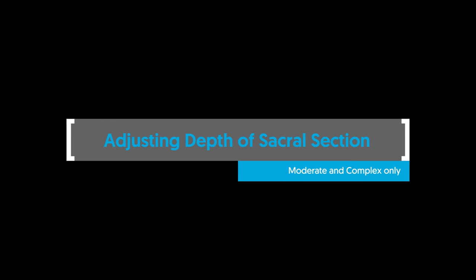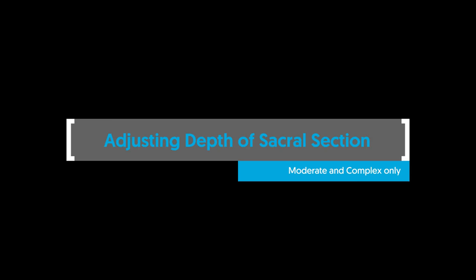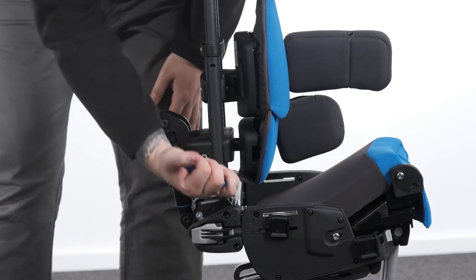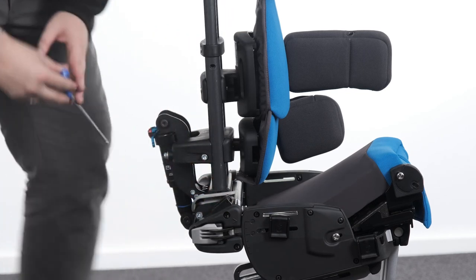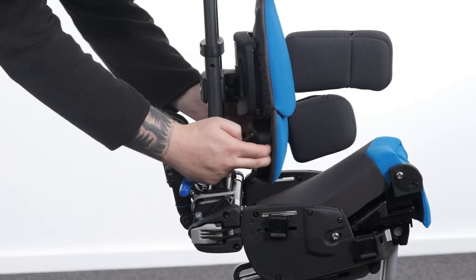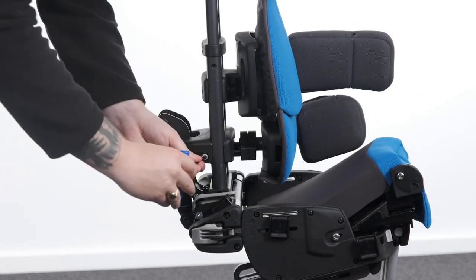Adjusting depth of sacral section — moderate and complex only. To adjust the depth of the complex clamp, loosen the bolt at either side of the clamp. Adjust the depth by moving the backrest section forwards or backwards to the desired position. Tighten the bolts to secure in position.